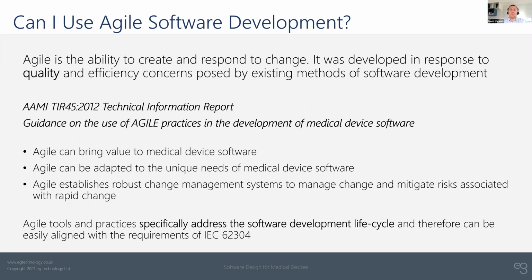So the best processes we tend to find are those which really mesh between what the developers are familiar with and willing to work to, and the requirements of 62304 and medical device development in general.